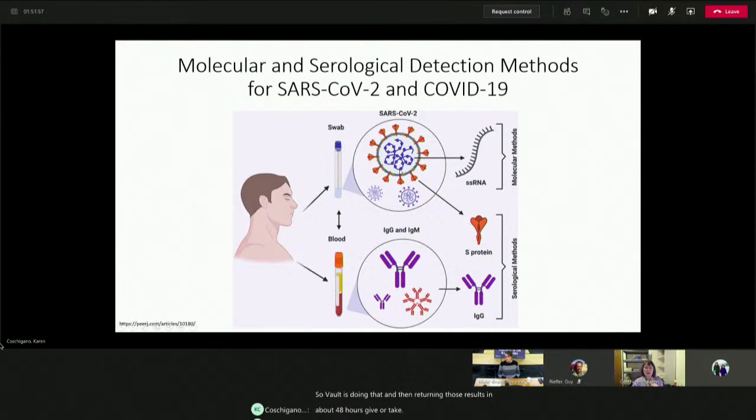There's a second method that we're using on campus, what we're calling the rapid test. That's by Abbott, and it's called ID Now. It also detects the RNA, but it's not doing the cycling. I didn't even talk about that, but it's a little bit different method than what I'm doing for my reverse transcription quantitative PCR. It also is quantitative in a sense, not quite in the same way, but it's giving a signal based on whether it sees RNA. There are also two other types of methods. There's a method that can look for protein from the virus.